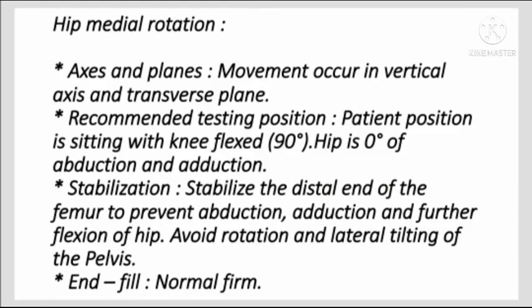Hip medial rotation, axis and planes. Movement occurs in the vertical axis and transverse plane. Recommended testing position. Patient position is sitting with knee flexed 90 degrees. Hip is 0 degrees of abduction and adduction.